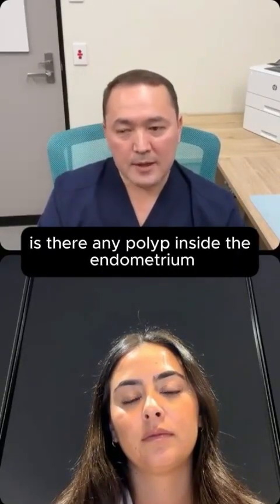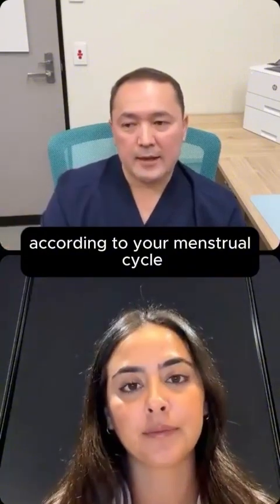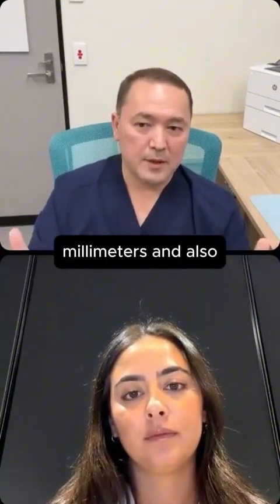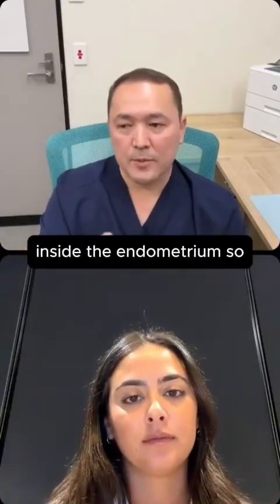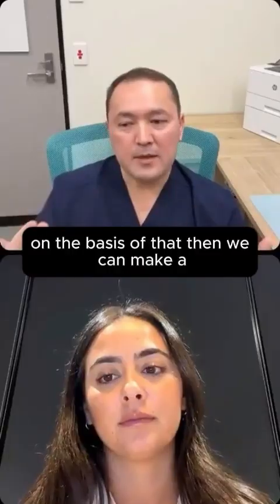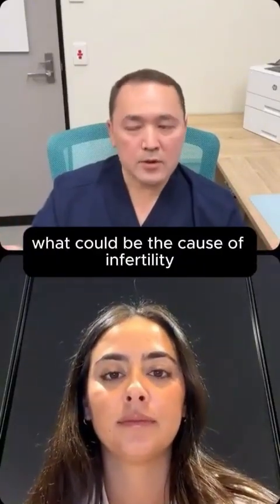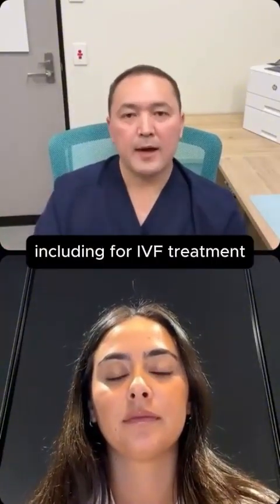Is there any polyp inside the endometrium? And also endometrial thickness according to your menstrual cycle. Let us say if you're doing a scan in the mid-cycle, your endometrial thickness should be more than 7 millimeters. And also it should tell us whether there's any fluid inside the endometrium. So these are the minimum requirements for a baseline ultrasound scan. On the basis of that, we can try and understand what could be the cause of infertility and make a plan for fertility treatment, including for IVF treatment.